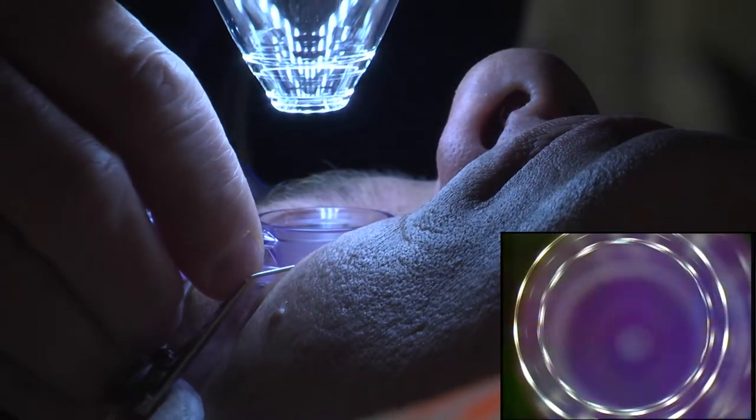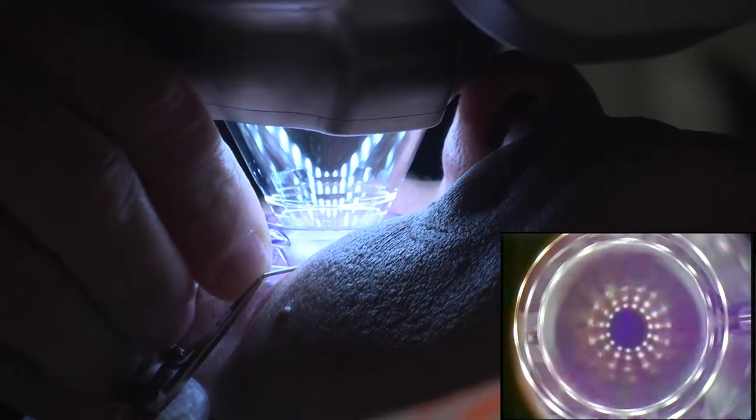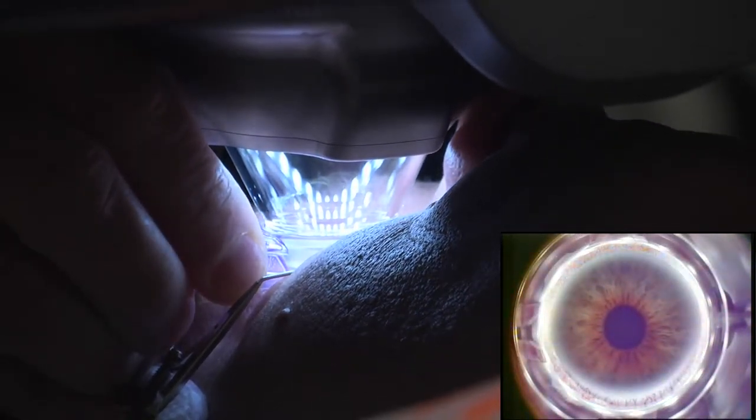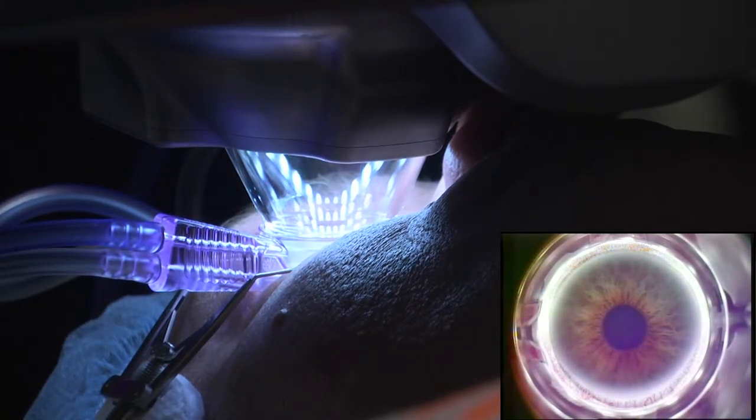Your vision's going to dim out. Are you doing okay? You're doing a really good job of not moving your hands or feet. A little more pressure. And now you just keep relaxing. This is a good time to not talk or move.